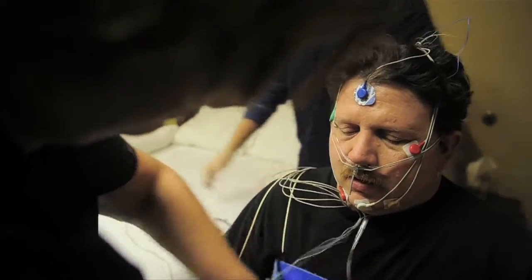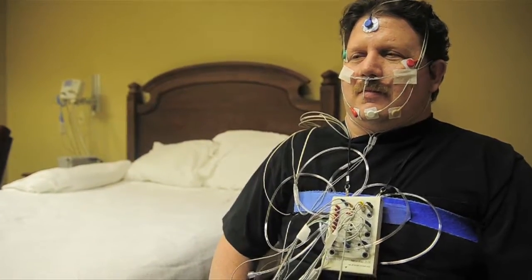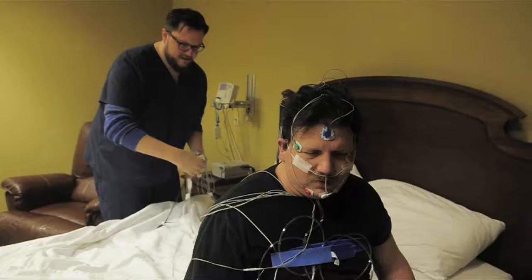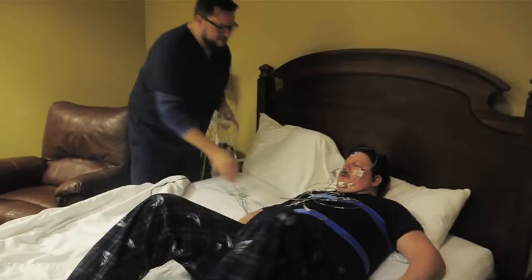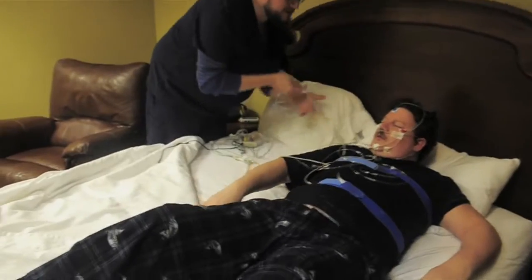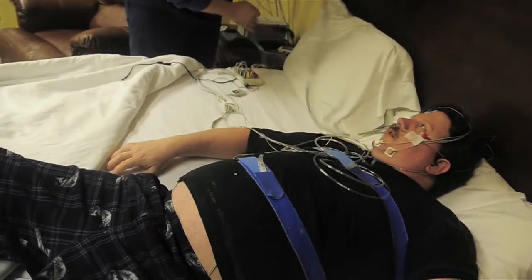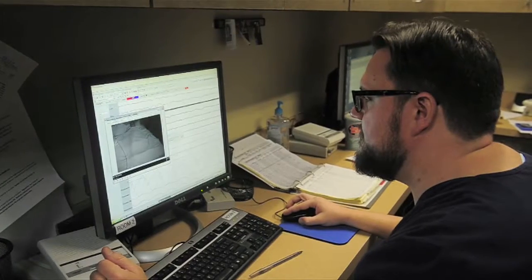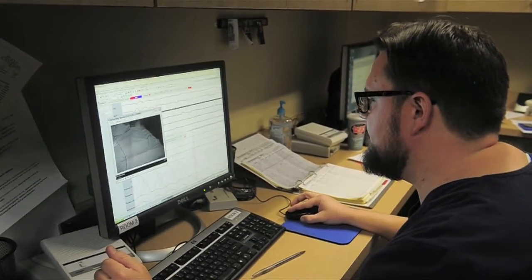We have two sensors that go right under their nose that show when air is coming in and out of the nose and mouth, and that's how we're able to catch the air actually making its way through the airway. The last thing, right before they go to bed, we put a little sensor on their finger called a pulse oximeter that monitors the amount of oxygen in their blood. From there we hook them up and watch them and see what happens.